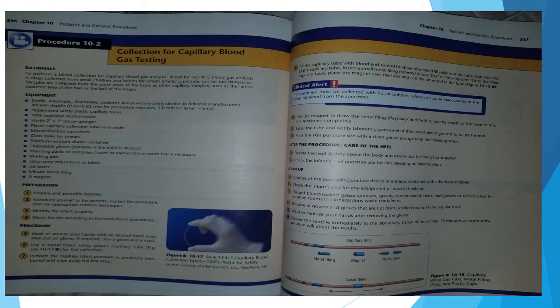Equipment: sterile automatic disposable pediatric skin puncture safety devices in different manufacturers' incision depths. Heparinized safety plastic capillary tubes. 70% isopropyl alcohol swabs. Sterile 2x2 gauze sponges. Plastic capillary collection tubes and sealer. Micro collection containers. Glass slide for smears. Puncture resistant sharps container. Disposable gloves, non-latex if the child is allergic. Warming packs or compress to warm heel if necessary. A marking pen. Laboratory requisitions or labels, ice water, minute metal filing, a magnet.